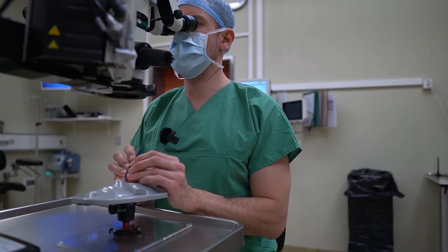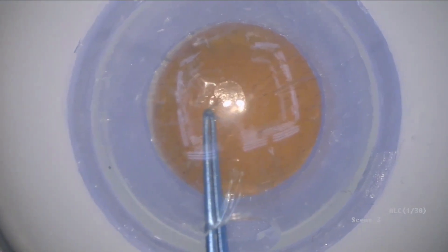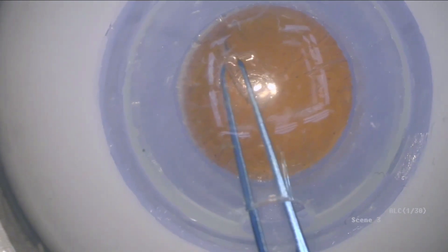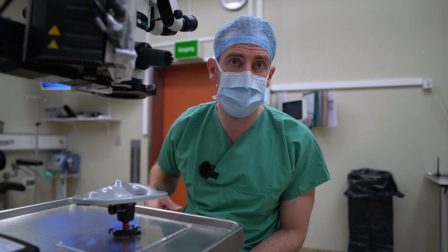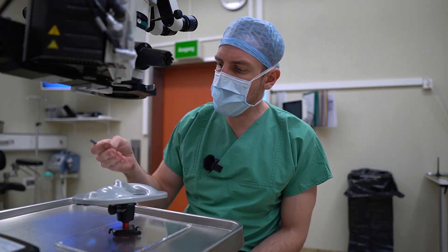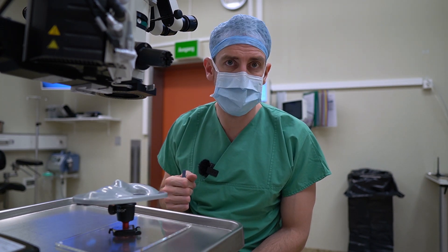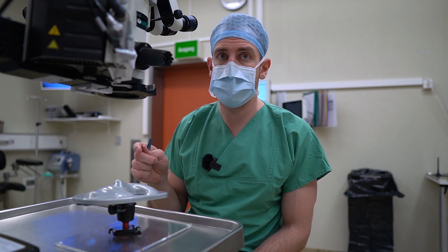Now we have the eye on the practice head. Let's dive in and check out how this feels without any filling of the anterior chamber. This is capsulorhexis under air. Reflections are a bit of an issue. Feels pretty good so far, maybe a bit too elastic for my taste. I just did one capsulorhexis with air inside of the eye — it is very hard to see and the capsule didn't actually react like a real capsule. So let's try something new.